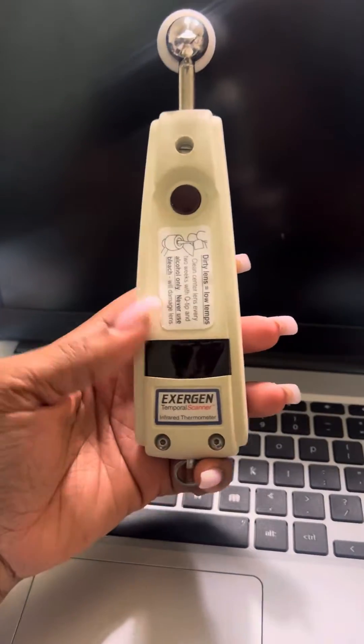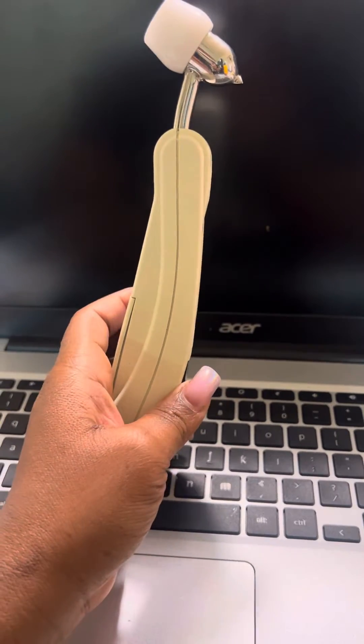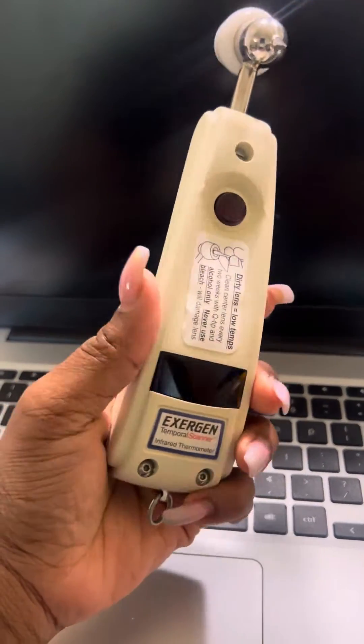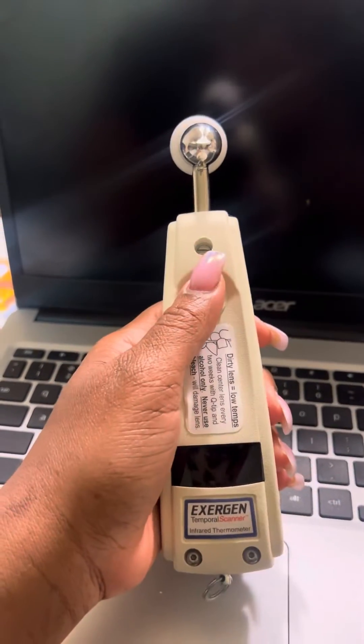I wanted to do a quick video on this thermometer here. I just got this off of the Bacari app, gently used for a good price. These thermometers are very good, but when I got it, it was doing this here.